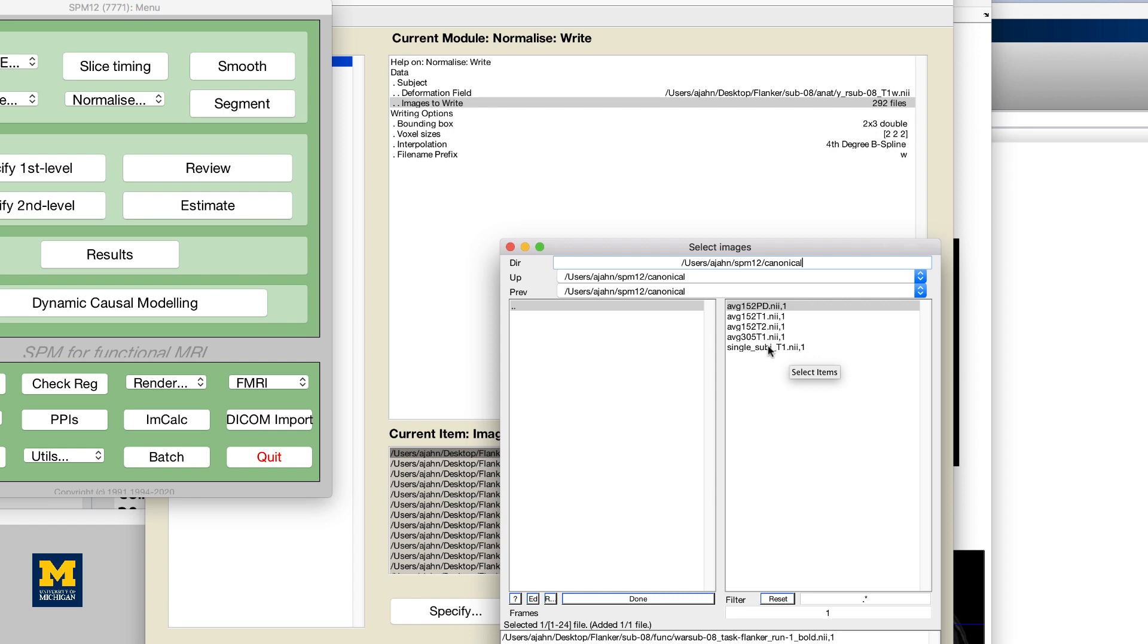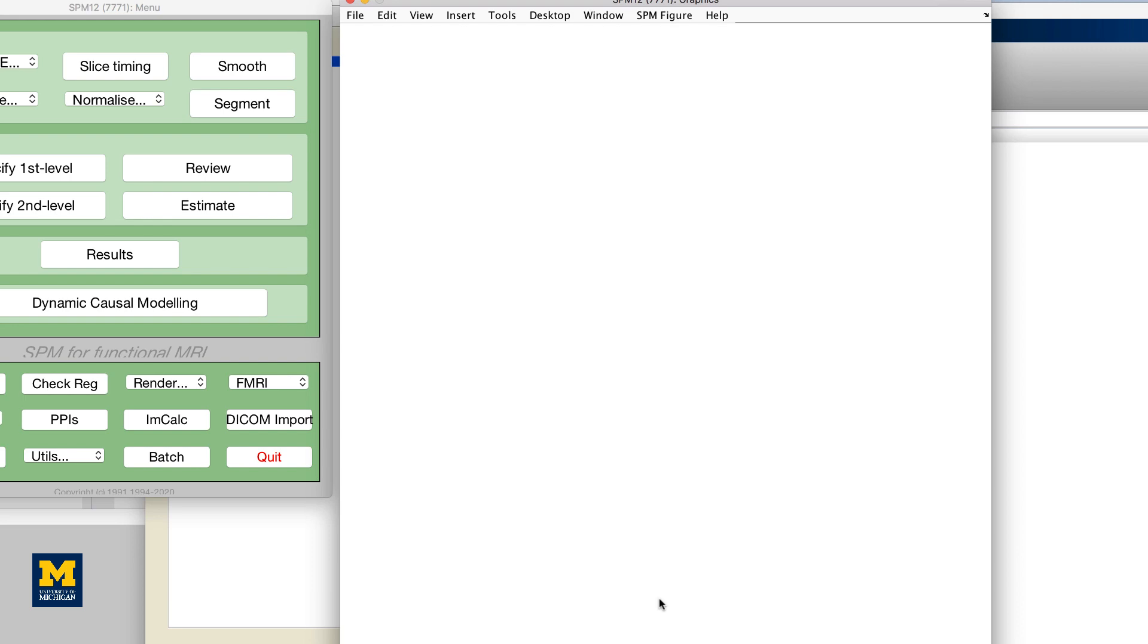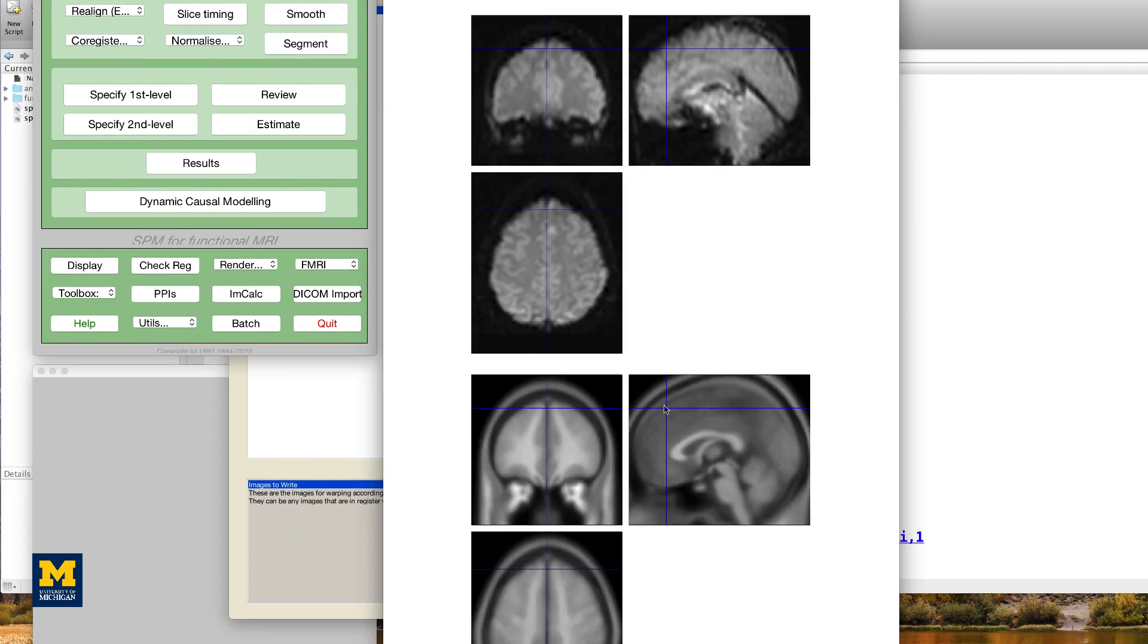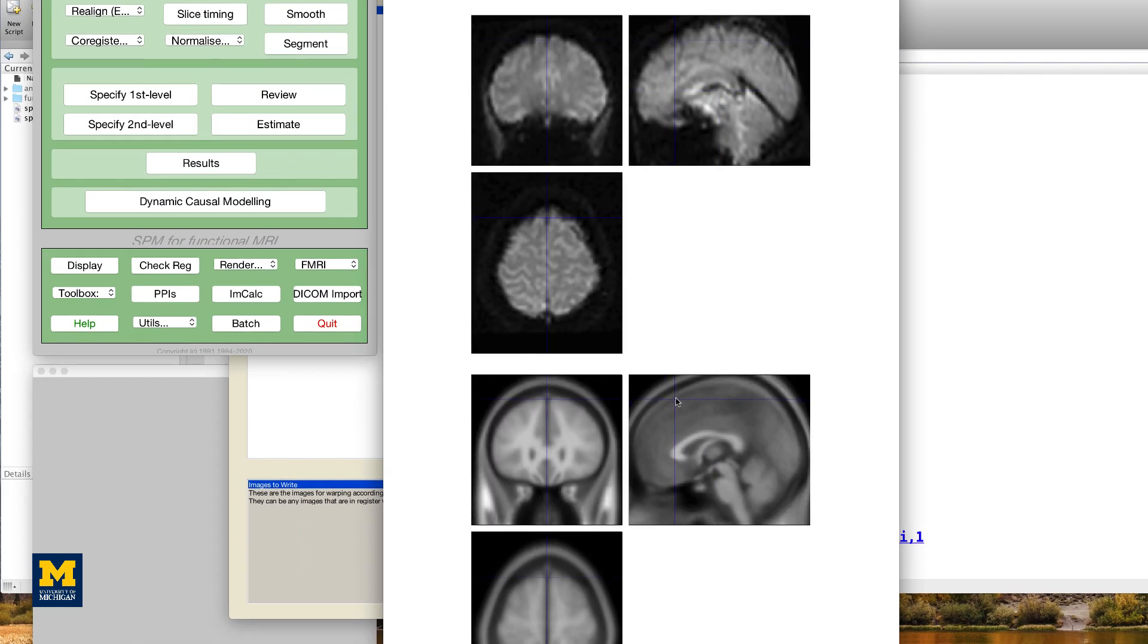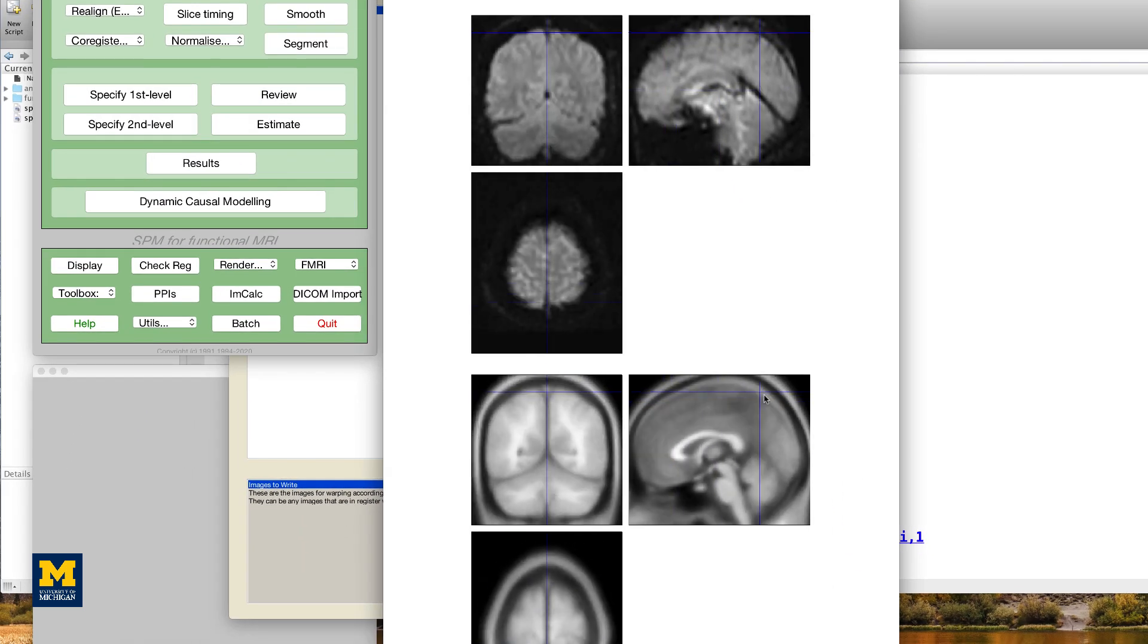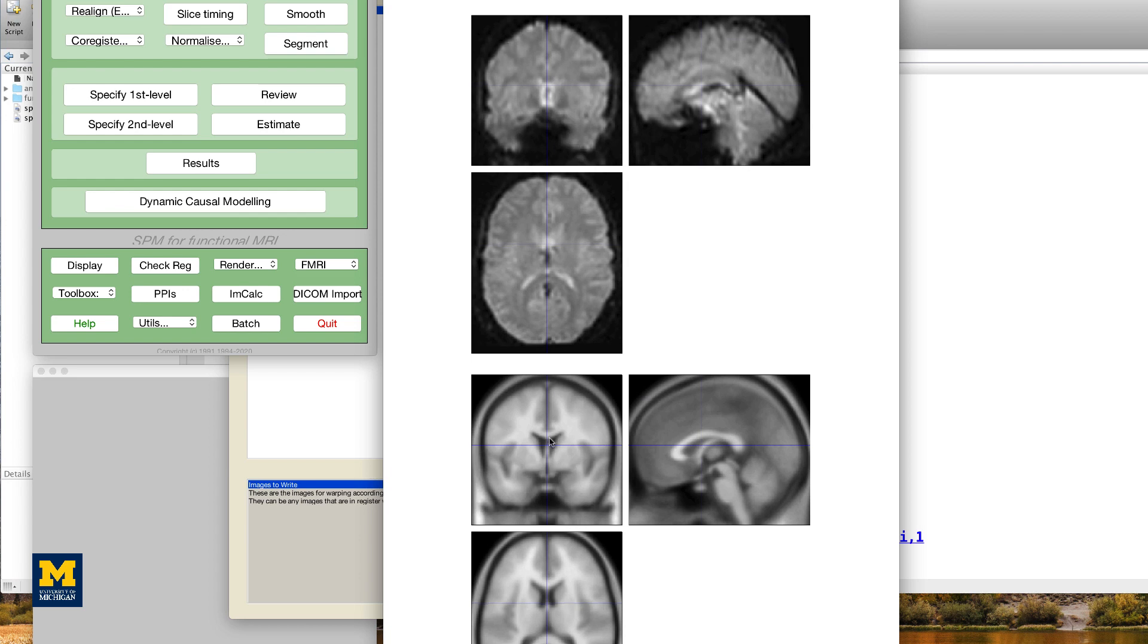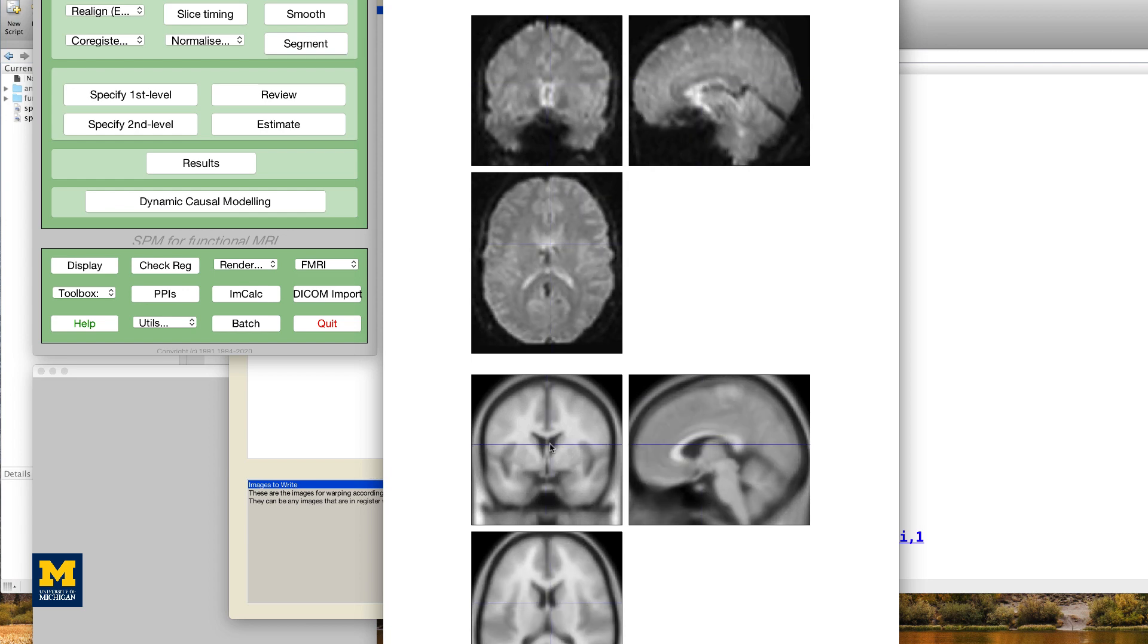In this case, I'm going to select the file average 152 T1. As with co-registration, check to make sure that both the outlines of the brains and the internal structures are well aligned.